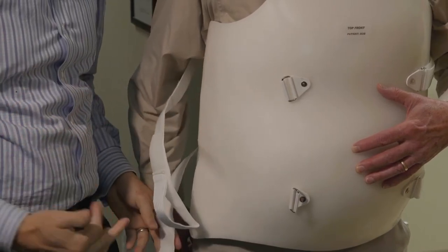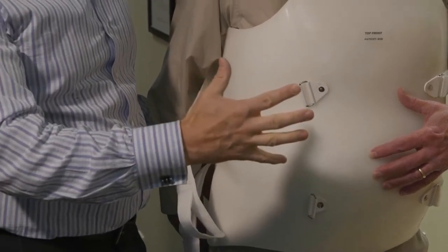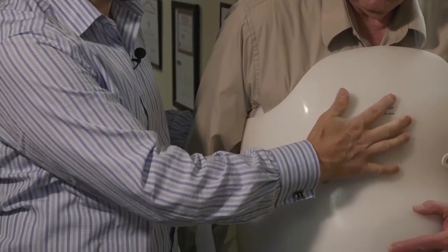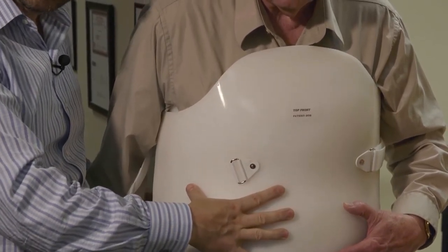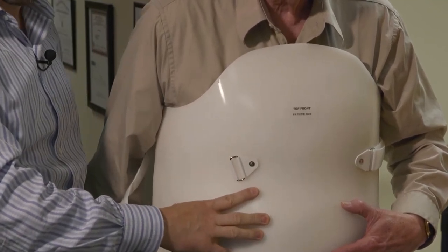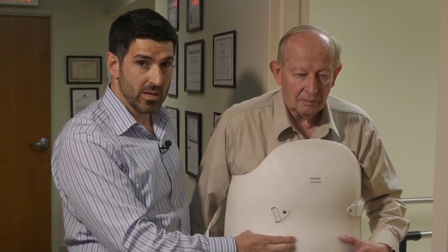So I'm going to show you how we tighten this up. This is us approaching the brace in the standing position. Right now, this is where the height is on Bob — once it's cinched up, this is where the height will be. Bob, is that in your sternal notch at all? Is it in your neck? It's not in his neck — he's straight. This is that X measurement I was talking about earlier, and it's really important for outcomes with patients. After the brace is on, they begin their activities of daily living, and we can really help them — or, if you don't take a few extra steps, sometimes they'll suffer.